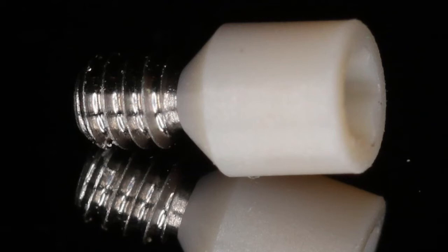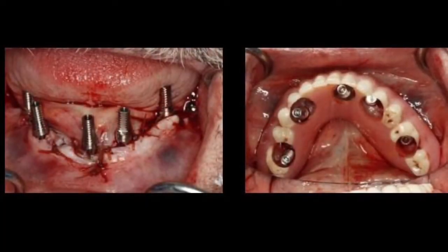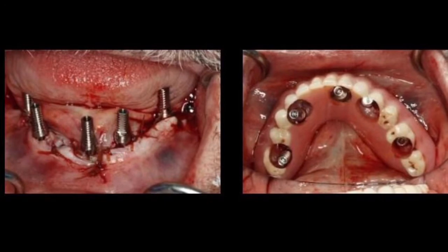This is the story of the separable fastener and how it came to be. It all started because I hated doing this to my denture — destroying a beautiful denture. But you had to do it because the temporary cylinders were so tall and you had to create those huge holes just to get access to them.